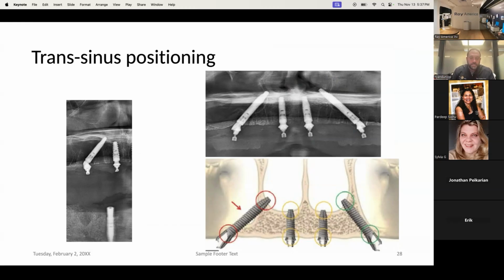So people are always shocked when they come to my classes and they just start doing surgery with us, because I and all of the mentors that I have in my courses, we put implants in at very high torque. And when I say very high torque, I mean more than 100 Newton centimeters. When people learn about implant dentistry, we learn about 35 Newton centimeters for torque, maybe 40, maybe 50. Otherwise, you'll get something called compression necrosis, right?